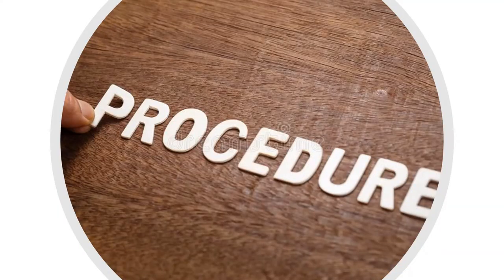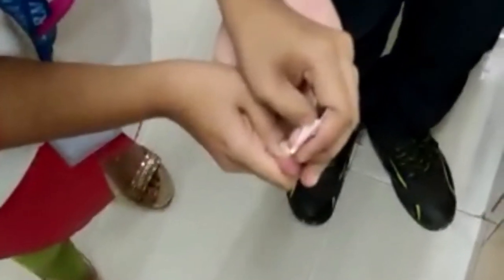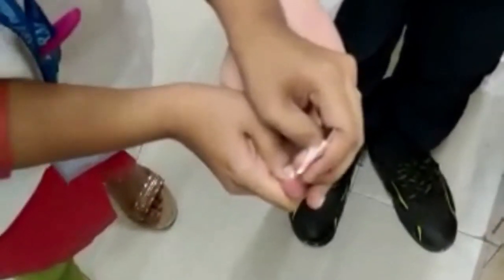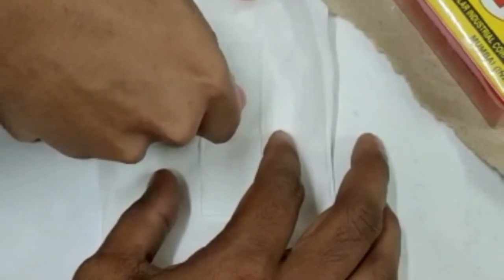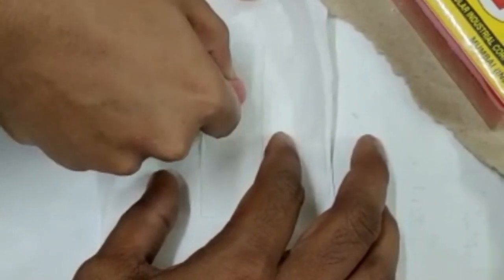The procedure: clean your finger nicely with the ethanol swab and take the lancet to prick. Make sure that you keep the blood on the tip of your finger and place the blood sample onto the glass slide. The blood drop should be thin or small.